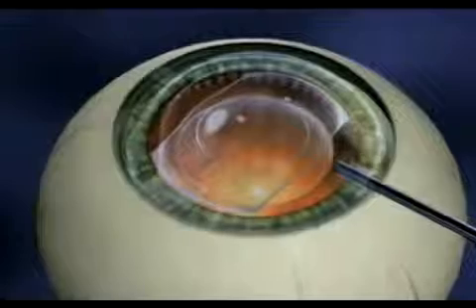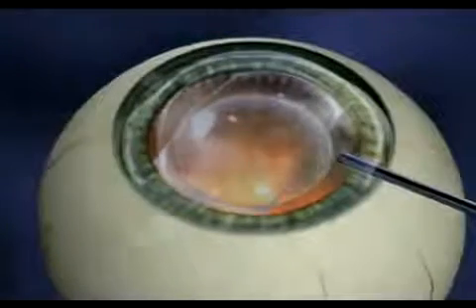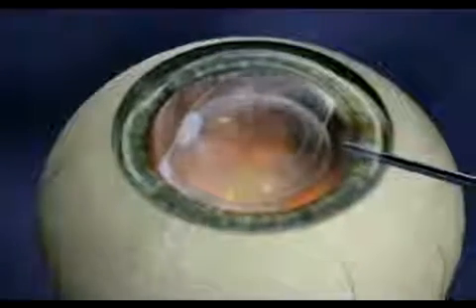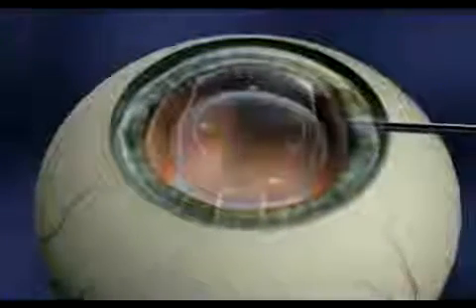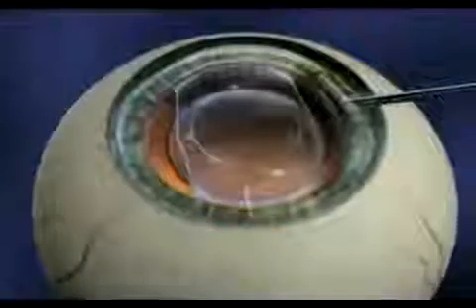Once the lens is in place, your surgeon will remove the gel-like substance. To complete the procedure, the surgeon will instill eye drops, which help prevent infection and inflammation. You will continue to use these drops for several days once you're home.